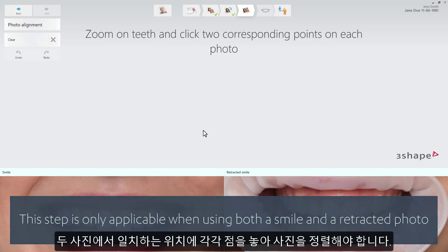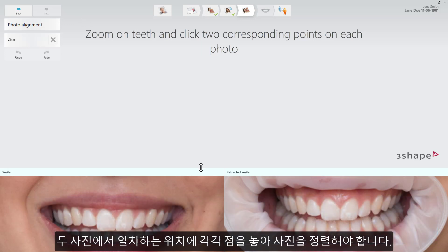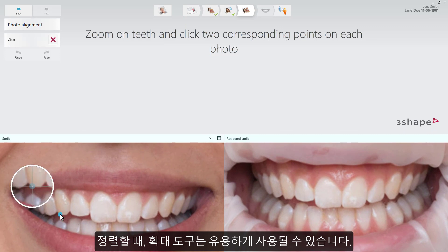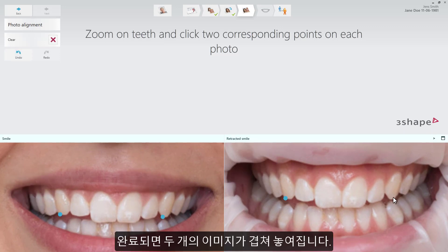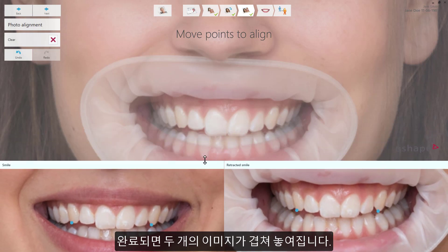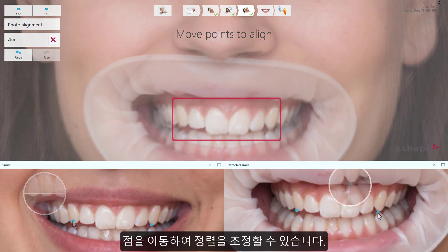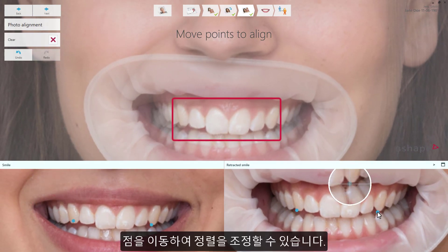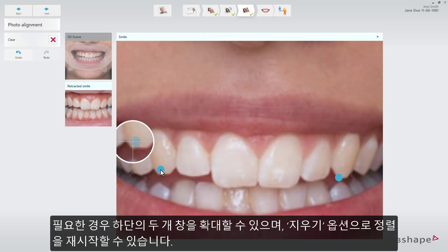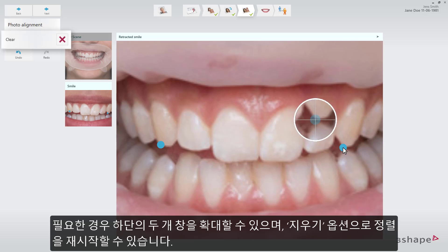Alignment should be done by placing two sets of corresponding points on the pictures. The magnifying tool is also available here to assist with placement. Once done, you'll notice the two images are overlaid. Move the points to make any needed adjustments. The two lower sub-windows can be enlarged if needed, and the Clear option will allow you to restart the alignment.